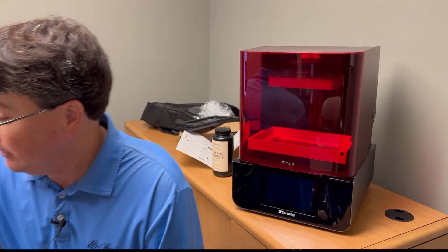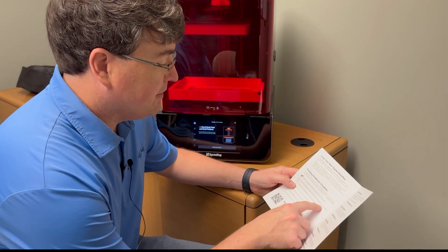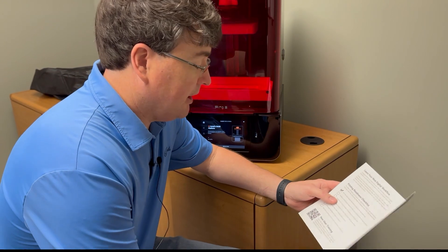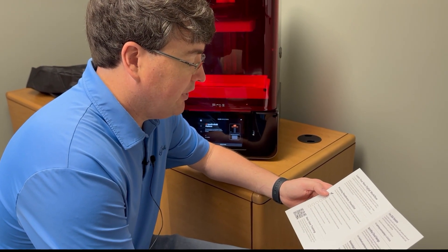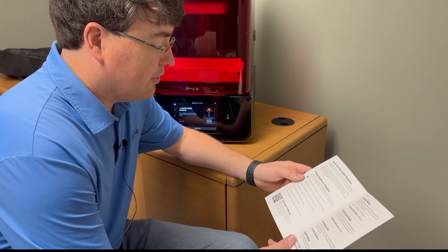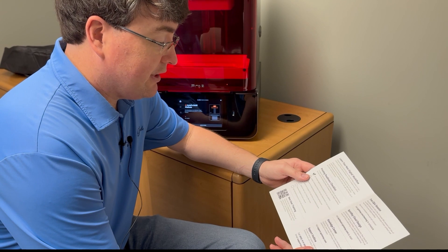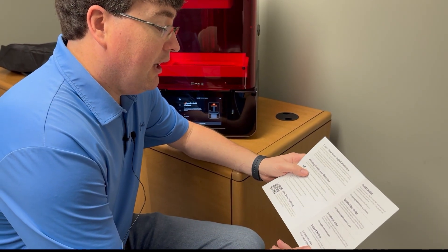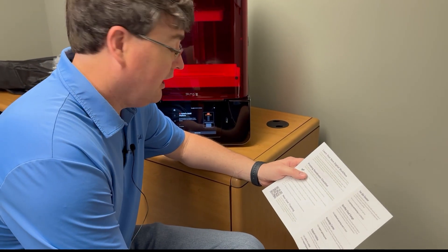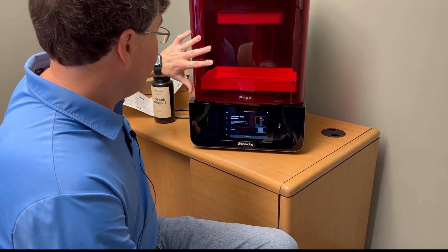Let's look real quick before I let you guys go and see if we missed anything in the welcome packet. Printing readiness checklist: create a workspace based on the size requirements of your product — as you can see, this doesn't take up much space. Register for cloud design at sprintray.com. Learn how to export STL files from your intraoral scanner, watch the new user training video series, download Rayware on your computer, and visit the sprintray.com store to view resins and accessories. I would scan this QR code, start your training, and get your free Q&A session scheduled.